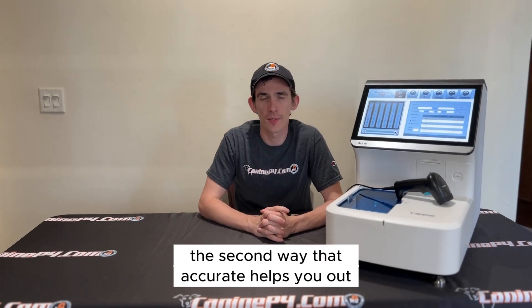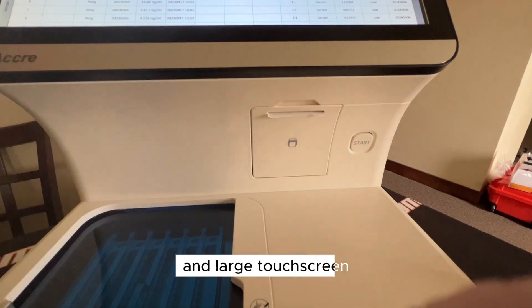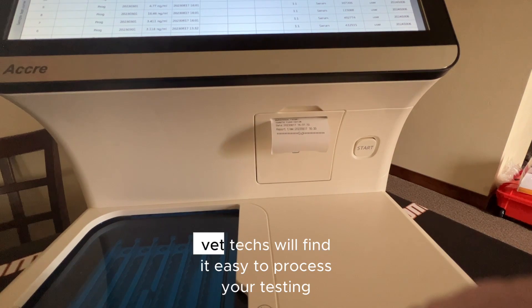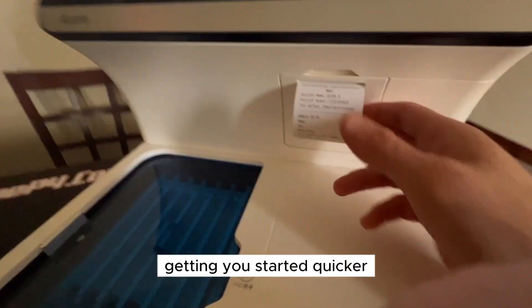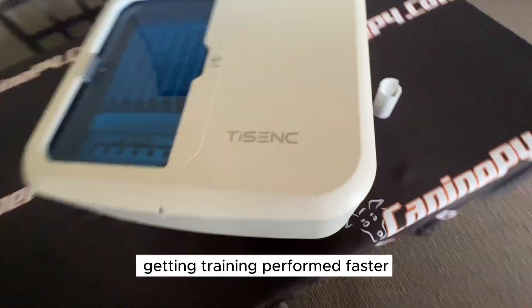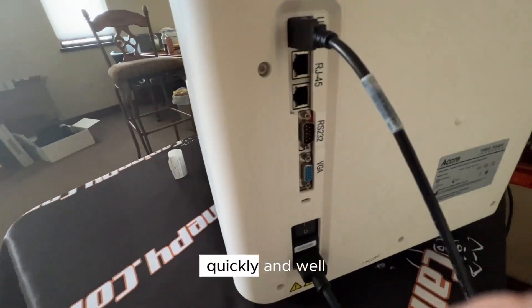The second way that the Accre 8 helps you out is with hassle. With its easy workflow, beautiful software design, and large touchscreen, your operators and vet techs will find it easy to process your testing, getting you started quicker, getting training performed faster, and keeping your samples run accurately and quickly.